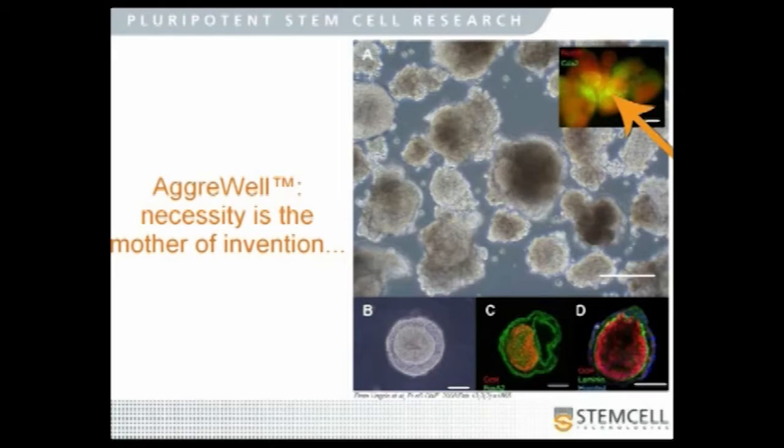So this is an example of where the local microenvironment, which is an uncontrolled variable, is overriding the macro environment that is controlled by the experimenter. And so this can cause obvious problems if you're attempting to direct differentiation to specific outcomes.